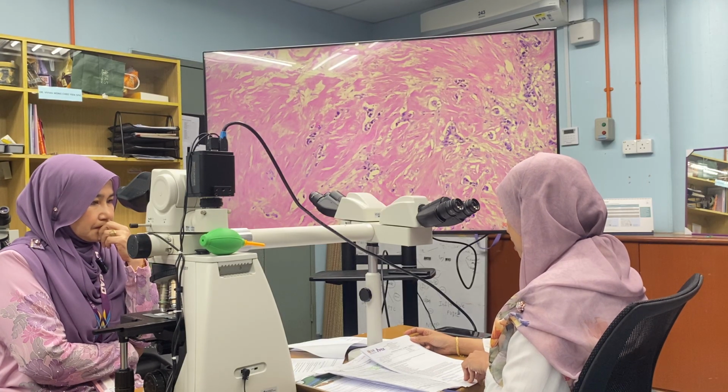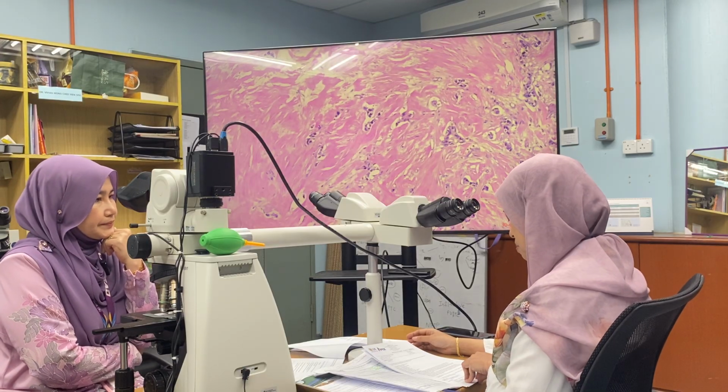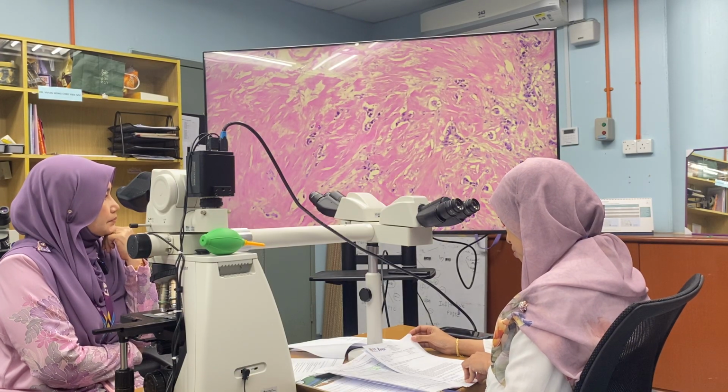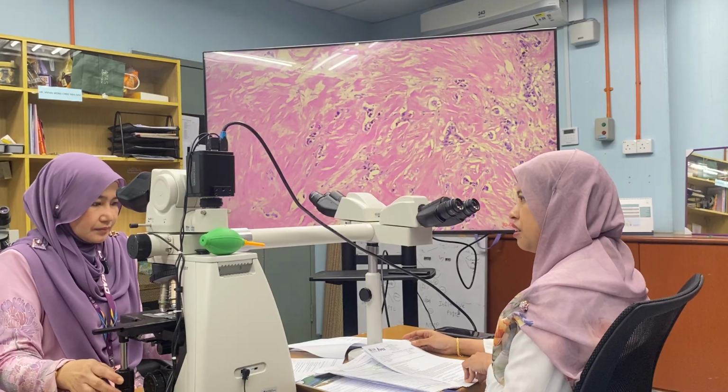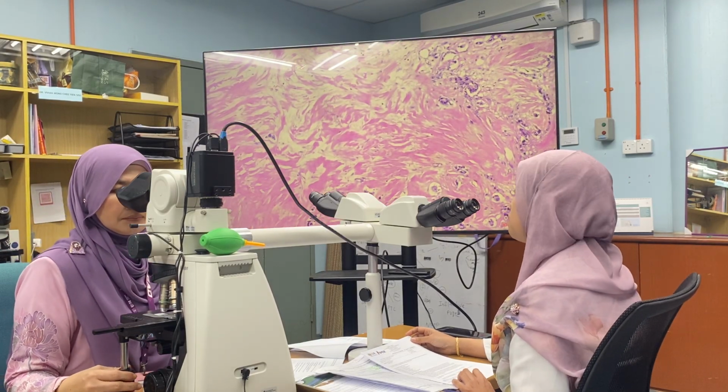The malignant cells are seen infiltrating into the muscle layer and also the overlying epidermis. Otherwise, no DCIS or Paget disease of the nipple is appreciated. Of the 9 lymph nodes, all are positive for tumor infiltration.